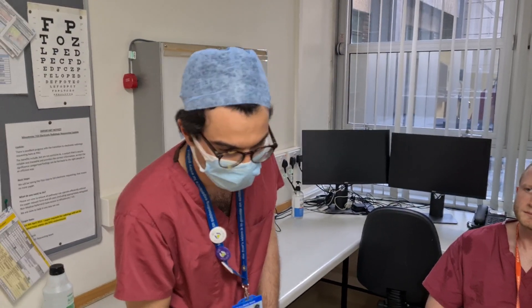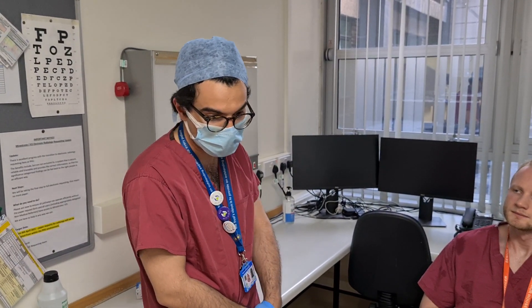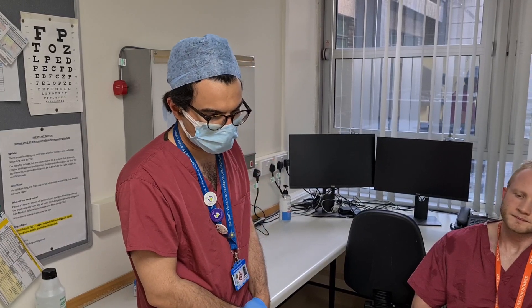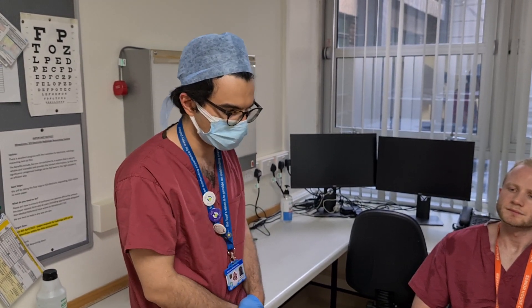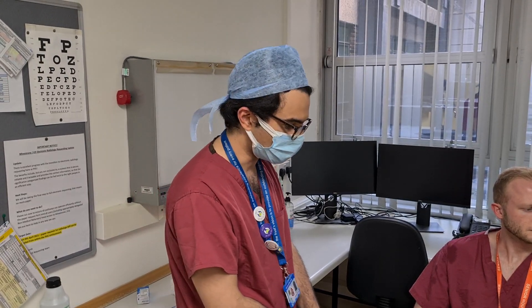It's always important to introduce yourself. It's important to adhere to your local protocol, as this is an aerosol-generating procedure and currently we're operating during a pandemic. So it's important to know what the local policy is when you perform this procedure, somewhere safe for yourself and for the patient.